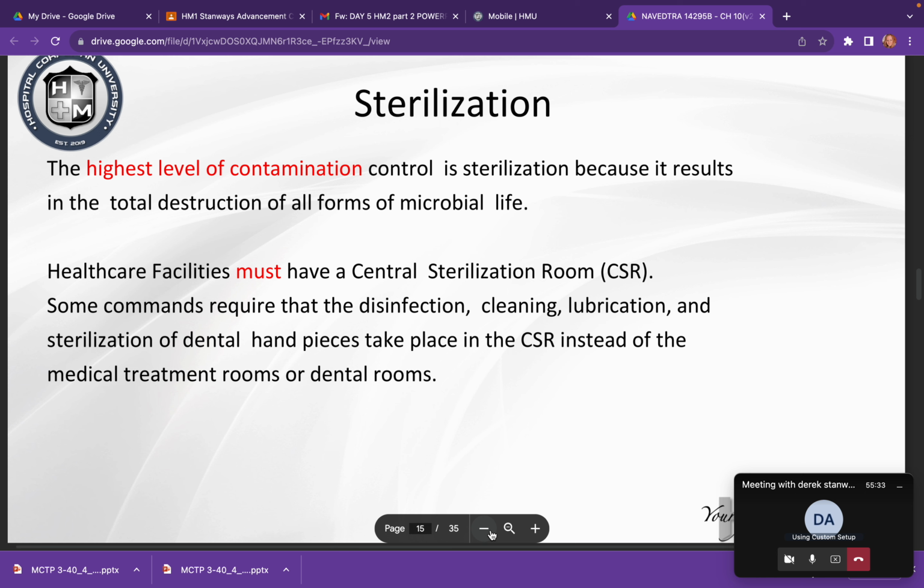potentially. Keep in mind there's two differences for the handpieces, right? For the handpieces, to test them out, this is before they're used, you'll be using that in the treatment room and hooking it up for that, I think it's a minute. I believe it's a minute, but you're testing out those handpieces to make sure they work. Now, the reason why you're not disinfecting those handpieces in the room is the main thing that I talked about. What is our main concern in dental for infection control? What is the biggest mode of transmission? Aerosols, right? So the handpiece sprays out water and air, right? So if you're trying to disinfect all that handpiece in the room, it's basically spraying all those contaminants around in the room and making it more susceptible for the patient to get that or to be picked up on something else.